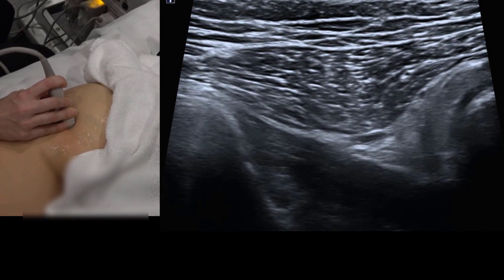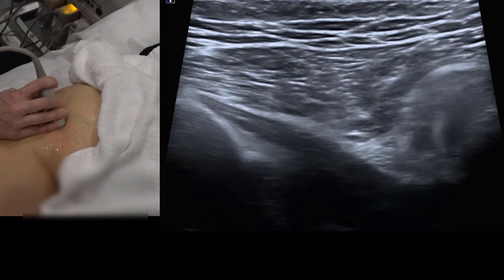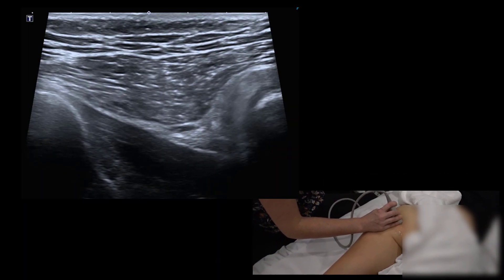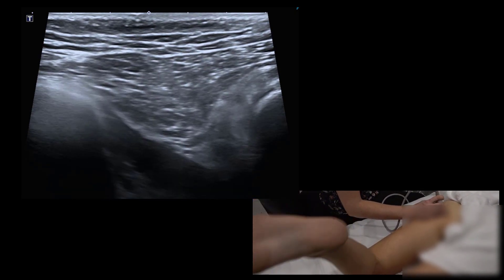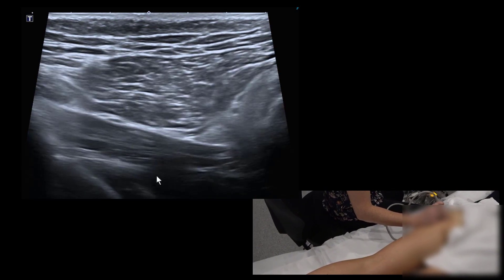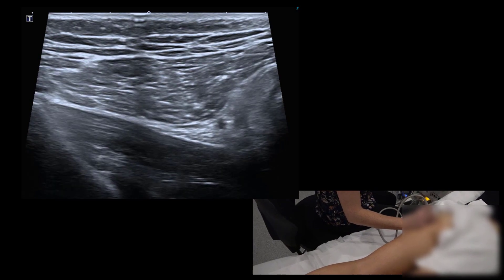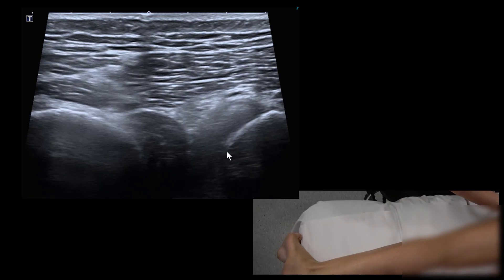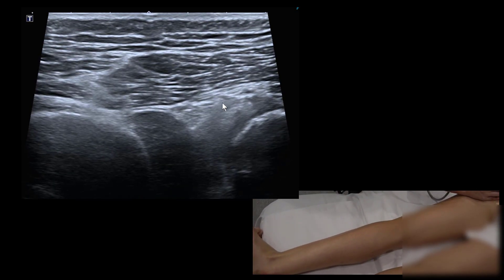We can change the shape and appearance of the quadratus femoris by internal and external hip rotation. To open the space, internally rotate the hip — ask the patient to turn the toes in, pigeon-toe — and you can see that widens the space between the ischium and femur. Externally rotating brings the bones together, causing ischiofemoral impingement.